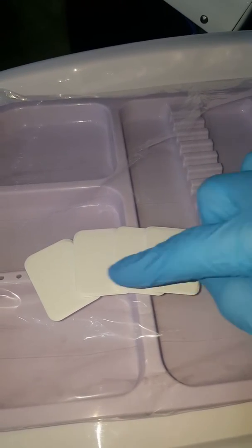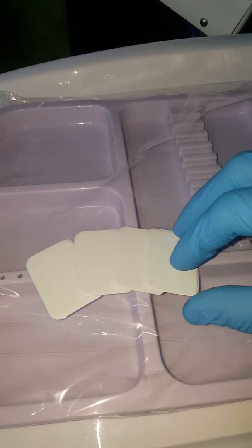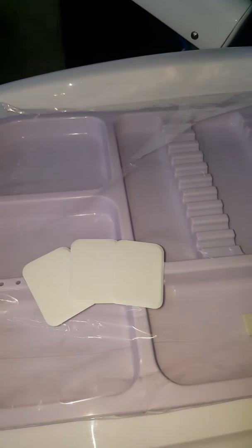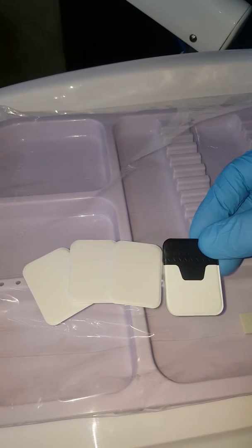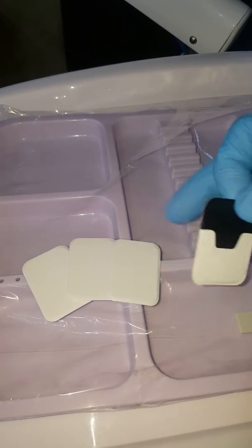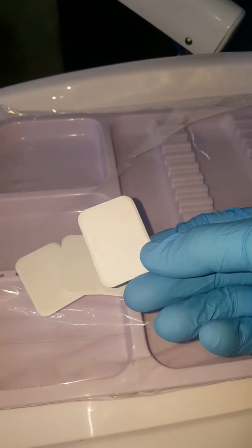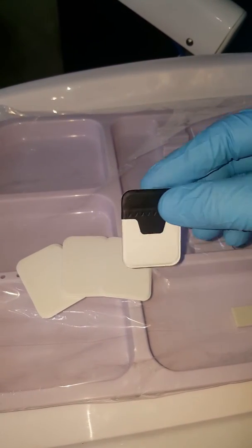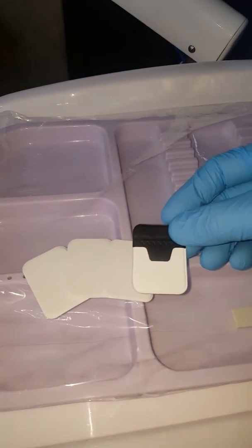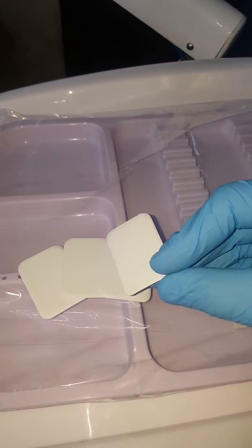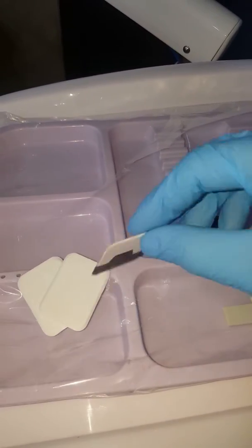Before I expose them, I always keep the white surface towards me. Once I have exposed the film, I turn it upside down to avoid the confusion of reusing the same film. This is like using the film as paper—there's nothing written on it and the paper is white. The moment you write on it, it turns a different color. So we expose the film and then put it upside down.